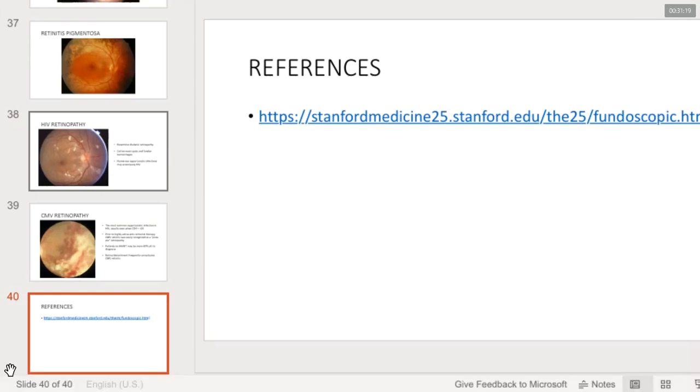So usually if we say that this is a normal cup disc ratio, what is the number that we usually quote? 0.3. Yeah, it's somewhere around that. Usually, in general, we say this, but you really need to see the disc itself to say whether this is a normal cup disc ratio or not. Because sometimes the cup disc ratio might be in the normal value, but still there is abnormalities at the optic disc.